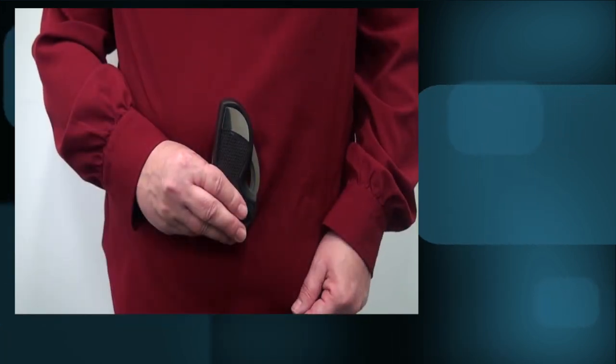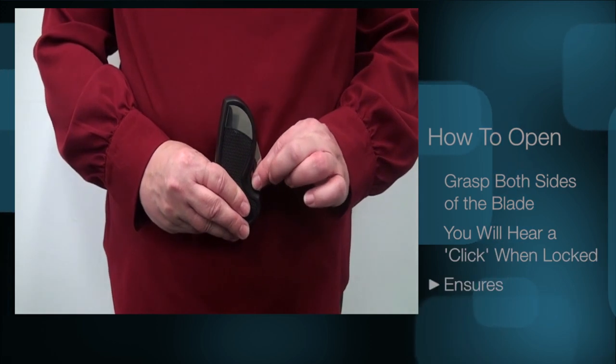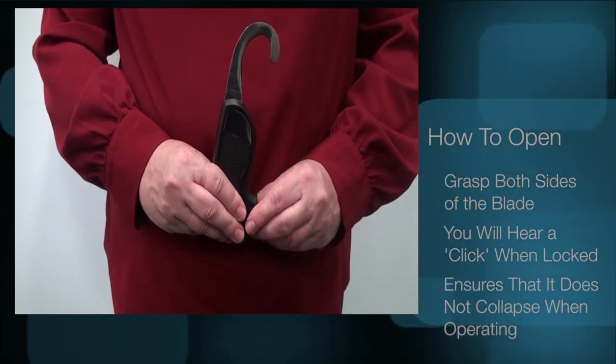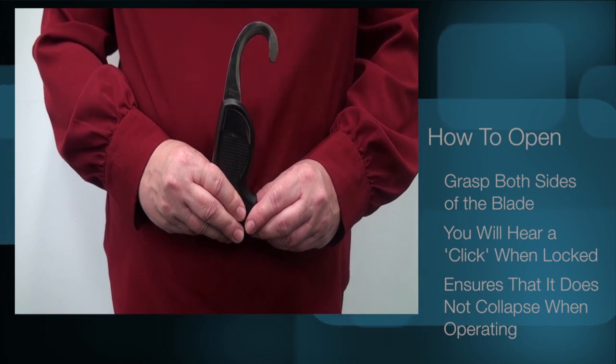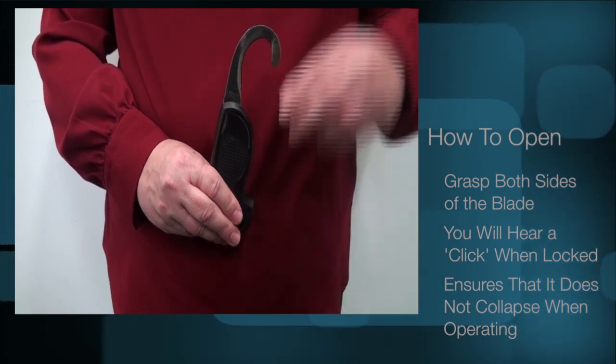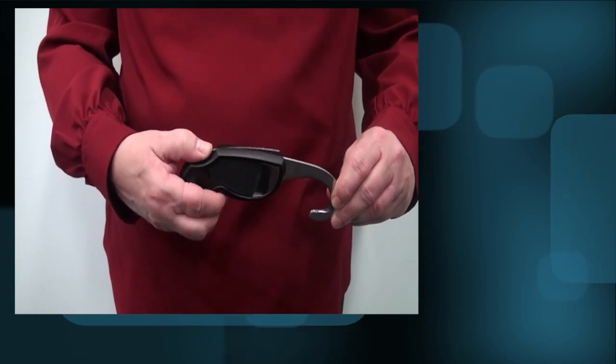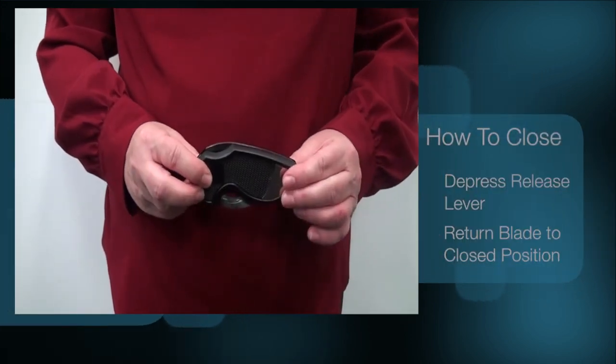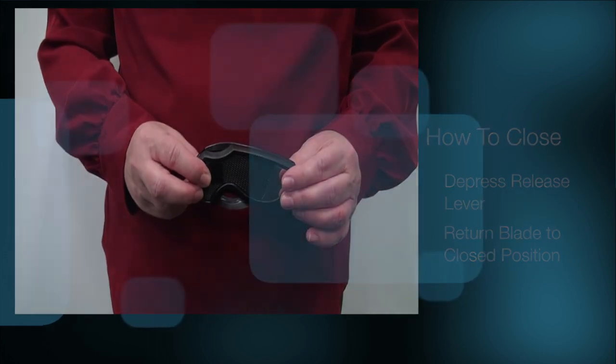The knife can easily be opened by grasping both sides of the blade. You will hear a click when it is locked in place, and this will ensure that it does not collapse on you when operating. To close the knife, depress the release lever located at the back of the knife and return the blade to the closed position.